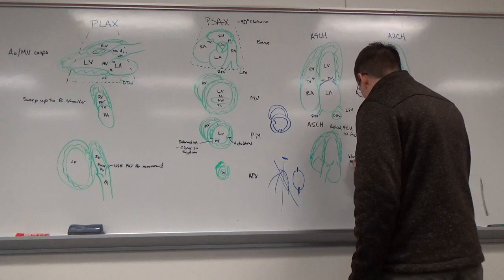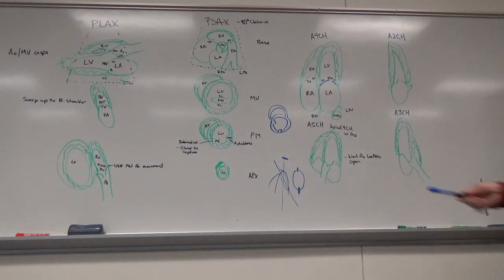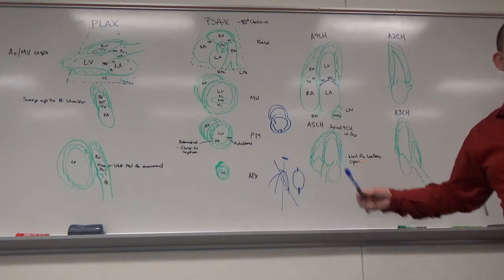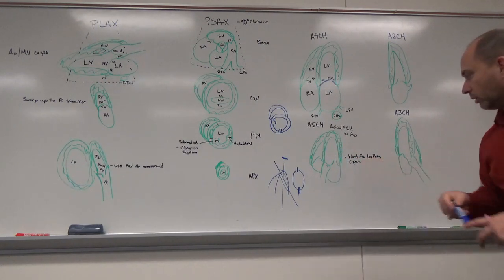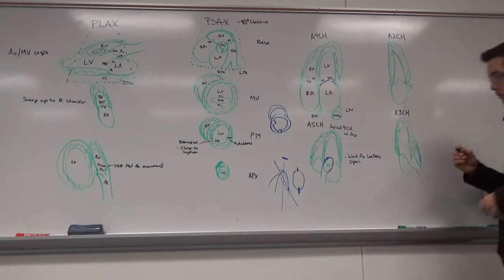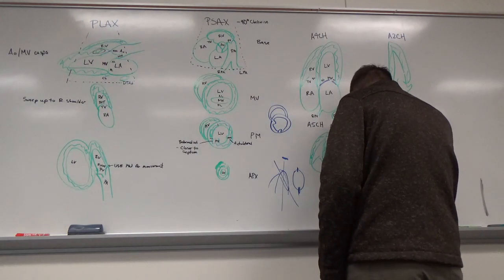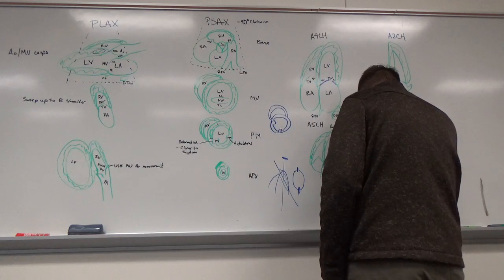So I really honestly don't care that much about how nice my ventricle's set up or the atria. You generally want to be in this perspective so you can see these 4 chambers, but what's most important is the valve itself. Okay, because this is also where we primarily do our Doppler, and if I don't have a good 0-degree angle, it's not good enough. Okay? Good, so let's label the chambers and vessels.